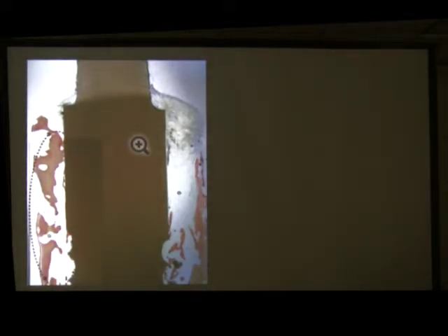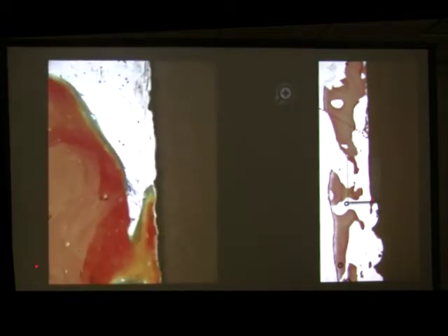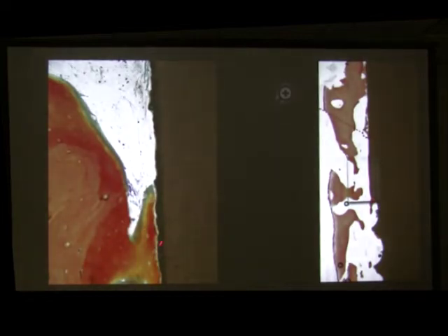And when we look at more areas of the implant, we see that there is a big marrow space, but when we zoom in, we can see that there is actual bone formation all along the implant, not just the threaded portion, but the transgingival portion of the implant. When we look at another area, we can see the new bone formation on the implant.